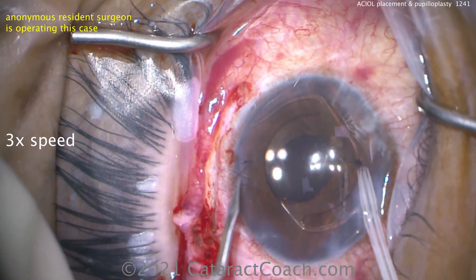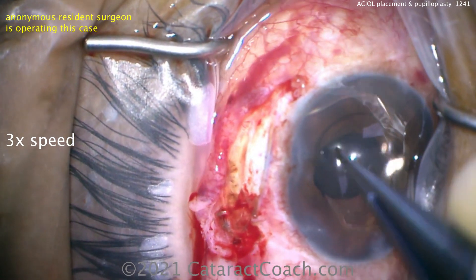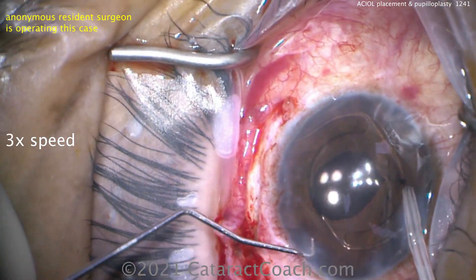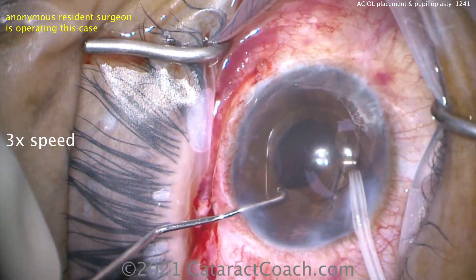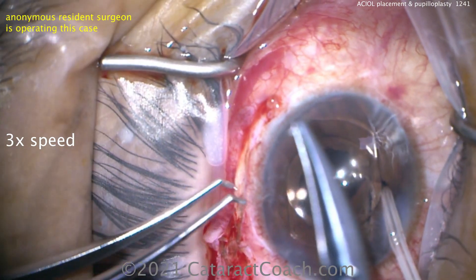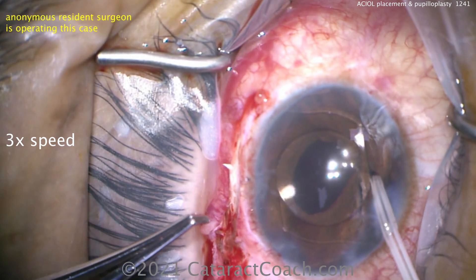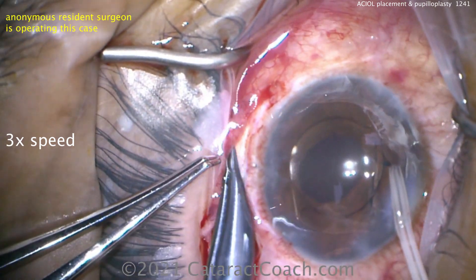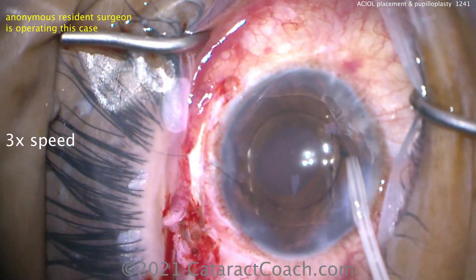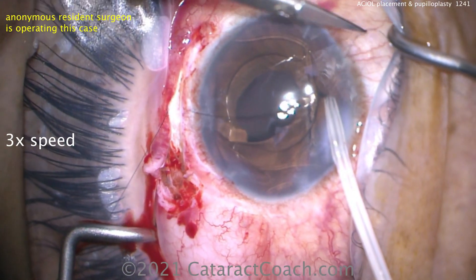Now we need to rotate this lens. The lens is at the patient's horizontal — 3 o'clock, 9 o'clock. We're sitting temporally, so in the video I want that lens to be straight up and down. Look at that — it's centering up nicely over that pupil. That's a 5.5-millimeter optic. You can tell the pupil in one meridian is about 4.5 to almost 5, and the other meridian maybe 3.5 to 4. This patient will dilate a little more, though the inferior part will not. Now suturing up that main incision — don't leave it open. You want this eye nice and watertight.